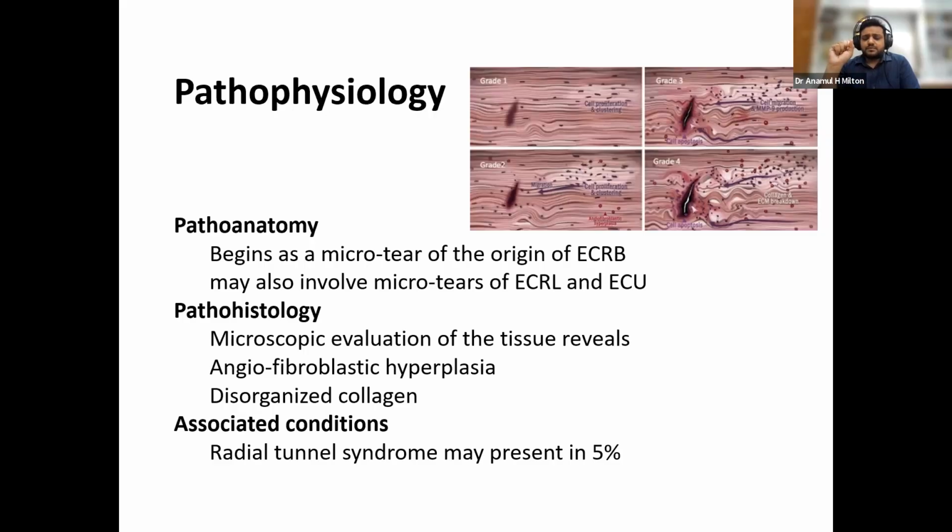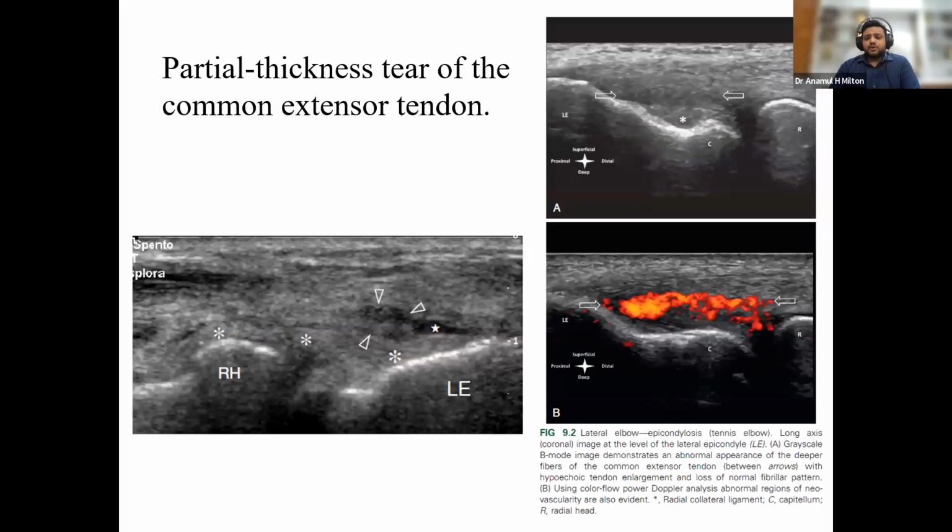Many times radial tunnel symptoms may be present in around 5% of this type of condition. Okay. If we see some ultrasound pictures, we can see it very easily in the slope.